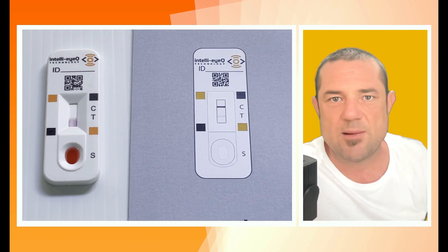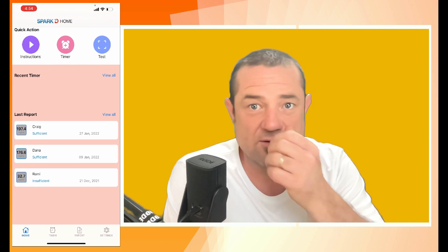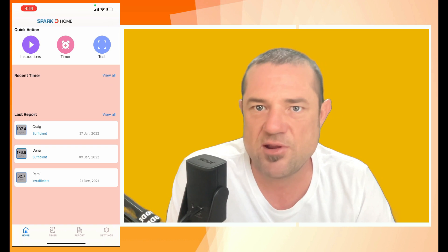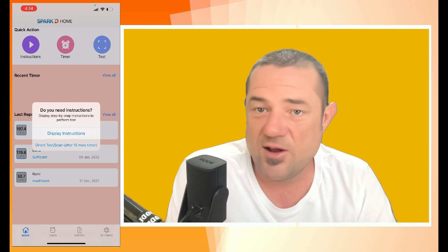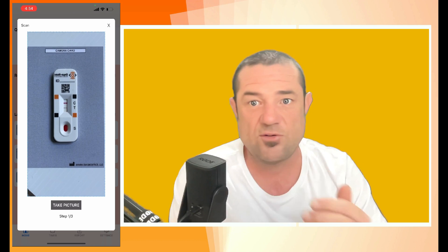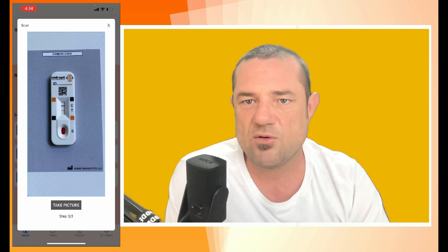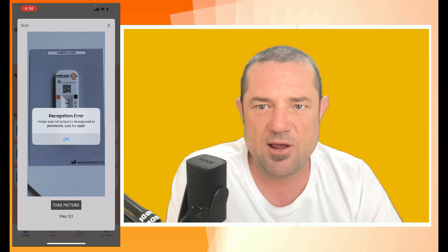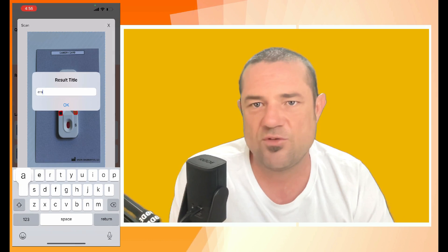I've got the app installed — there it is. It's got a couple of options: you can set a timer, go through the instructions, view previous reports, or run the test. I'm just going to run the test since I've done this before. You need to take three photos and it will line the picture up — you'll see red boxes come around. With a shaky hand you may get a recognition error; if so, simply take another photo. Then name your test result.